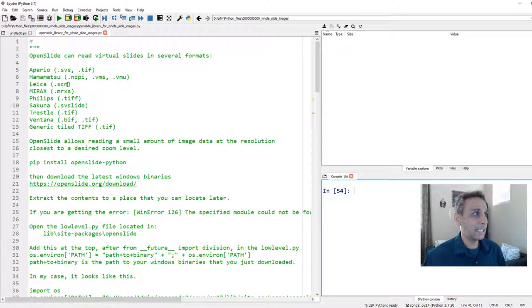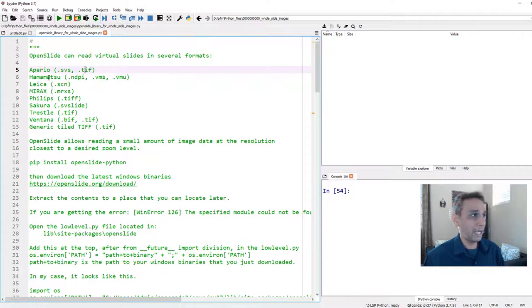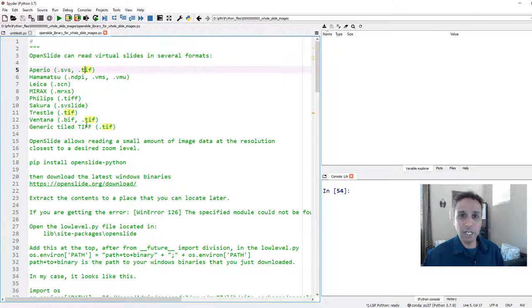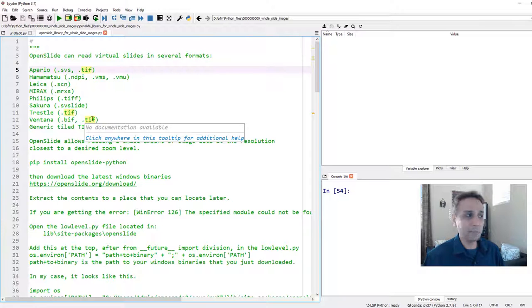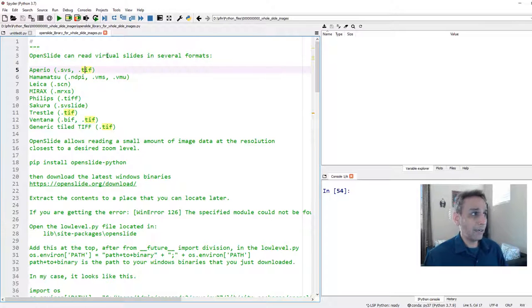SVS is probably the most common format — it's by Aperio. There's also the TIFF format, Hamamatsu formats, Leica, Mirax, Philips, and others. Sometimes it's just a TIFF file, but sometimes it's a proprietary format such as .SVS or .CZI or something else. OpenSlide can read all these virtual slide formats.